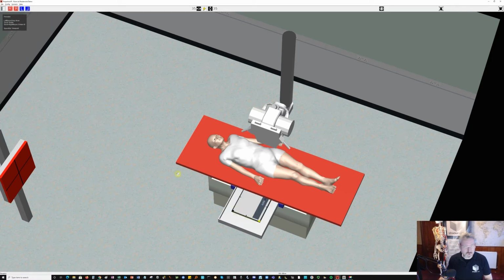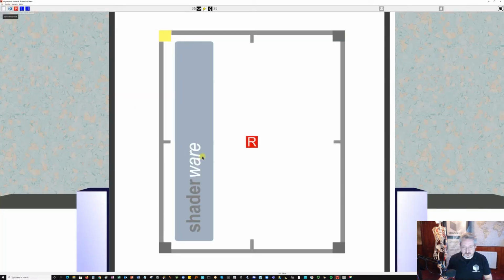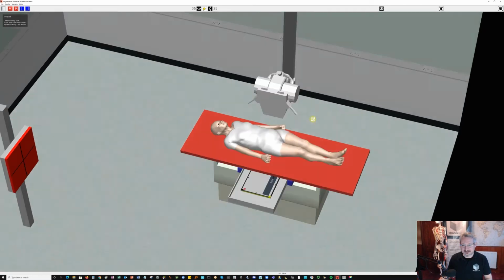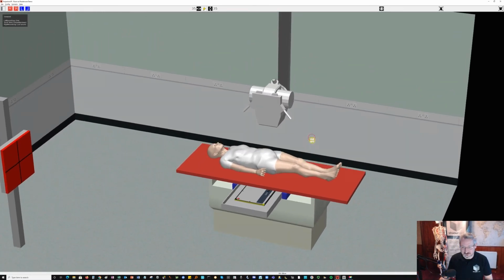So I'm going to continue to put a marker on though, because it's just habit. Okay, so just checking, I think the marker needs to go down here. Yeah, that's right. If I'm nervous about putting it down there in the pelvis, I'll put it up here in the corner. I can't stop myself from trying to do good radiography.